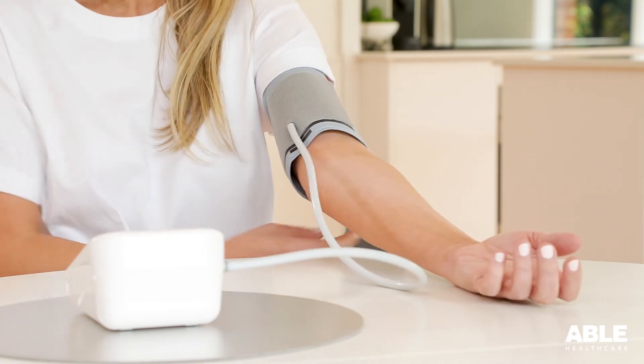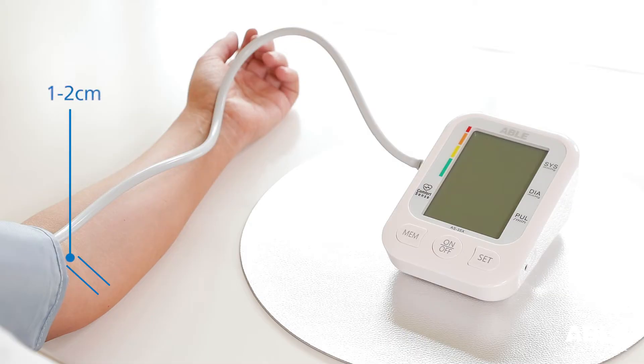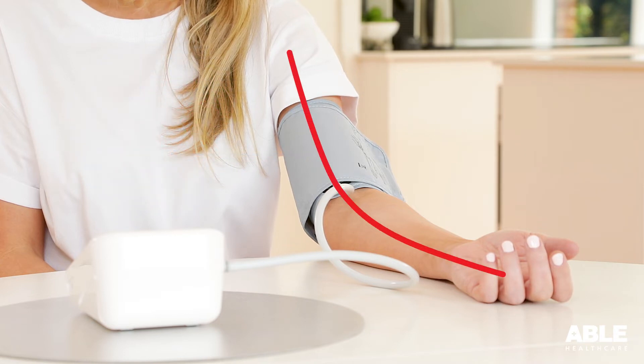Remove any thick clothing or roll up your sleeve and place the cuff on your upper arm, ensuring it is sitting one to two centimeters above your elbow and secure the cuff firmly. During the measurement, the cuff should be at heart level, ensuring the tubing placement is in line with your brachial artery.